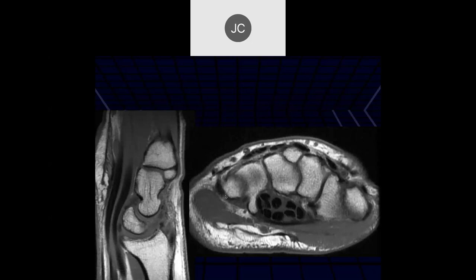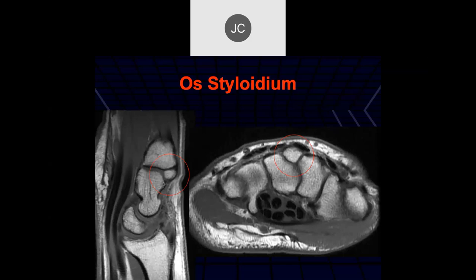On sagittal and axial views, there's probably a little dorsal angulation to the lunate. There is an accessory bone called an os styloideum. More frequently it's connected to the capitate producing a prominent dorsal capitate, but when it's congenitally a separate bone, it's called an os styloideum, and it can be a cause of a hard bony mass on the dorsal aspect of the wrist — not an infrequent reason for getting an MRI scan.